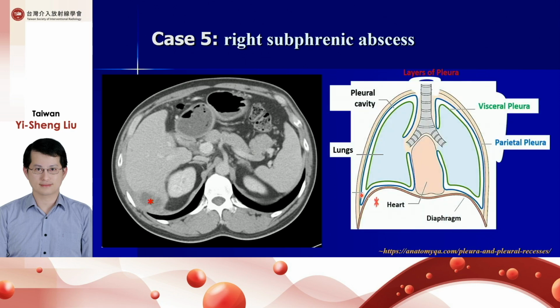And we don't want to puncture through the liver, spleen, or stomach. And what we most don't want is a transthoracic puncture. A transthoracic route could bring infectious material into the thoracic cage. And we know the parietal pleura is usually much lower than the lung base, so the caudocranial angle would be large.